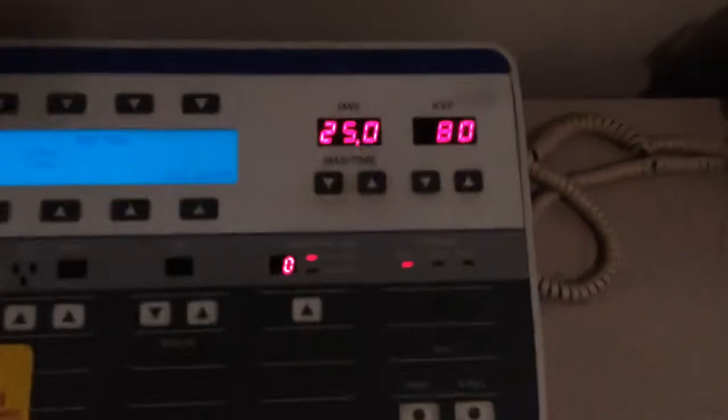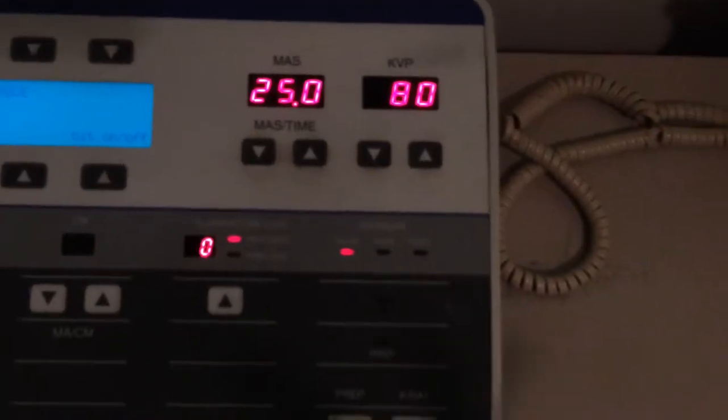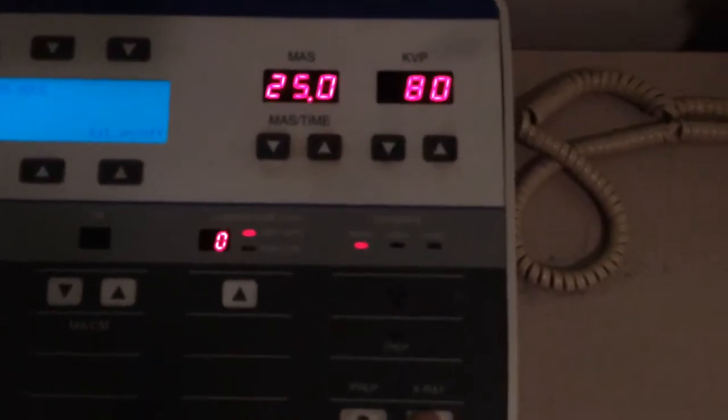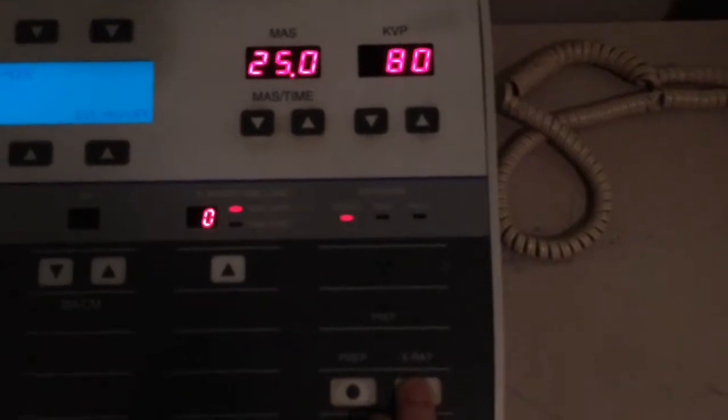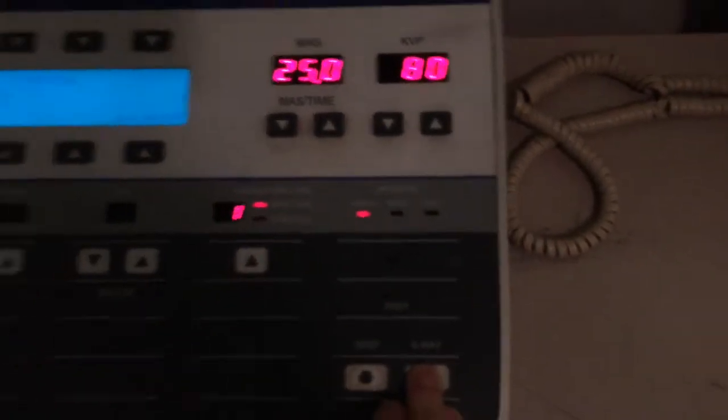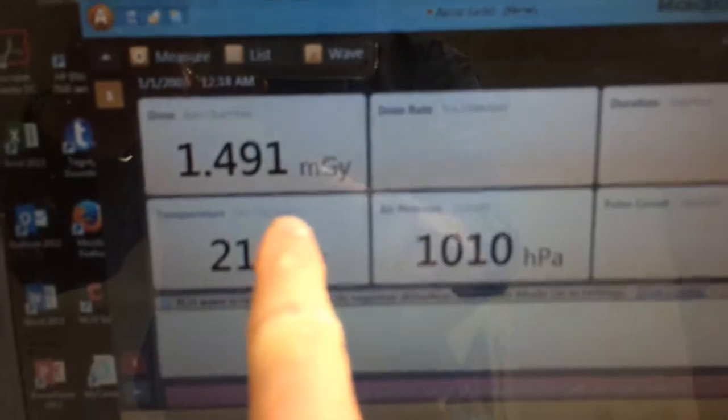To start the game rolling, we'll go into the lab and make an exposure. The technique that I'm going to use is just 25 mAs at 80 kVp. It'll be the same technique every single time. Let's go out there and see what we got. Over here, I've got an exposure amount measured in milligray.